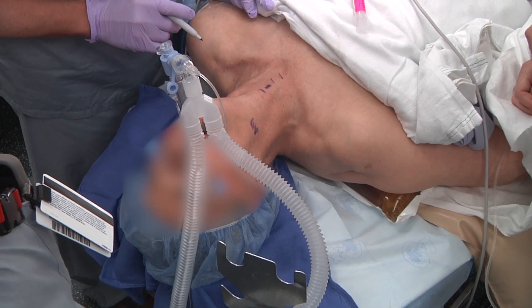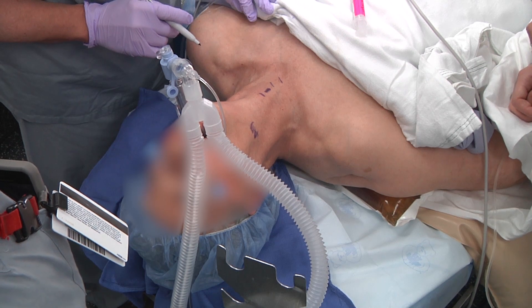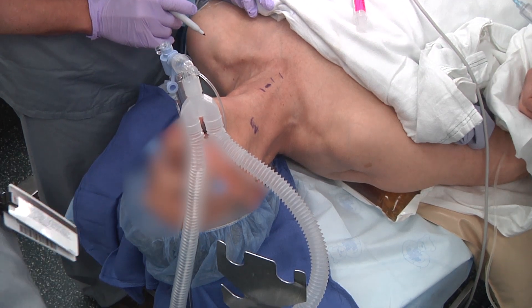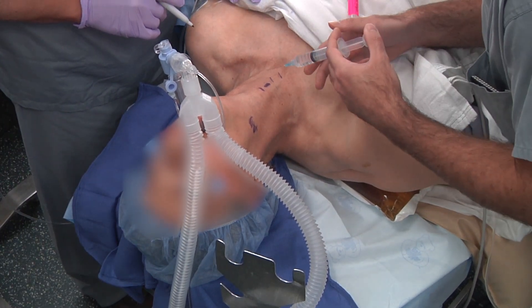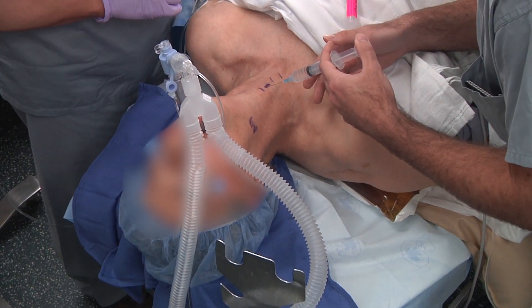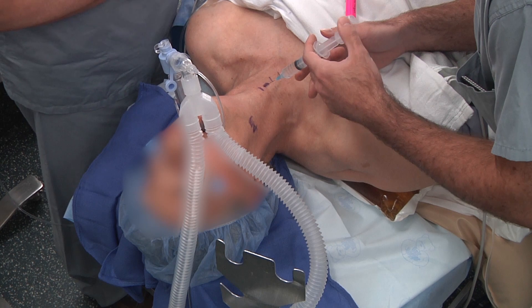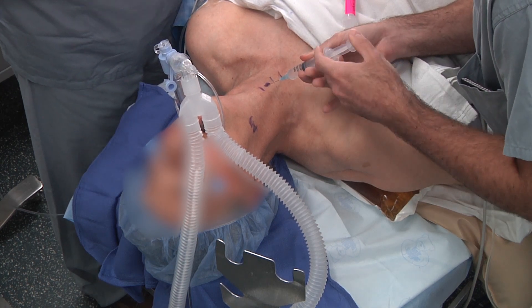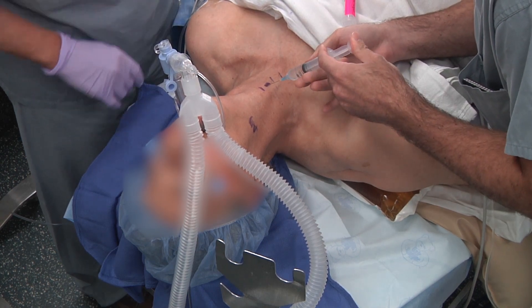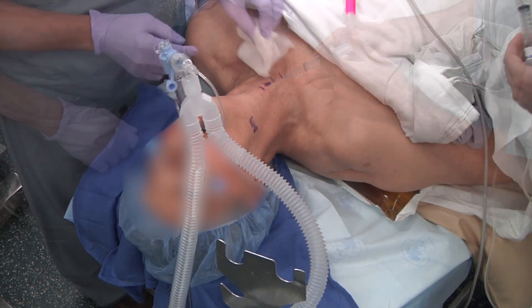A patient undergoing free tissue transfer surgery to the upper airway will initially have a tracheostomy with a laryngeal mask airway and total intravenous anesthesia.